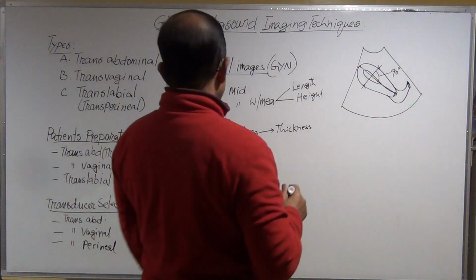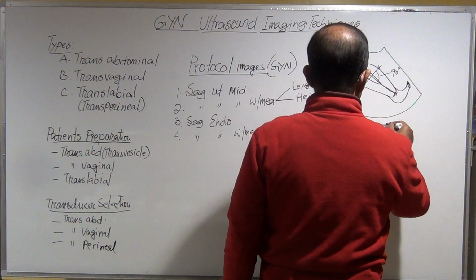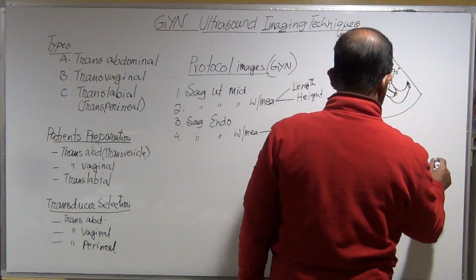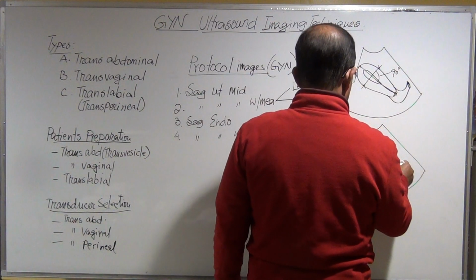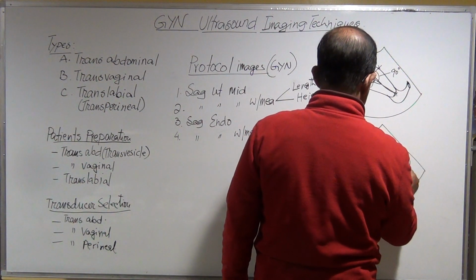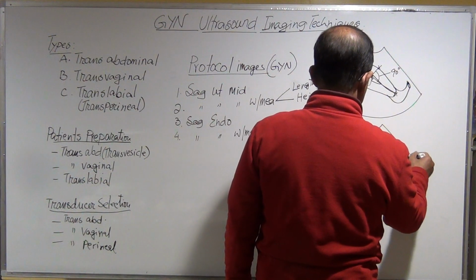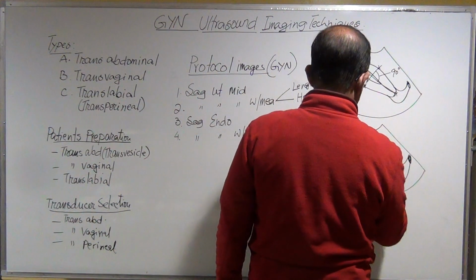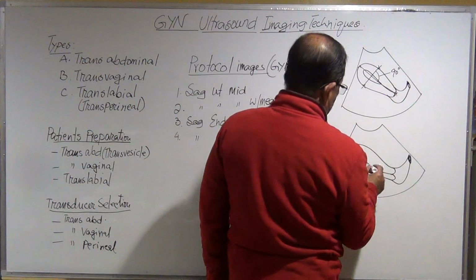And for the endometrium, take a separate image. It is better always. Okay, this is endometrium.